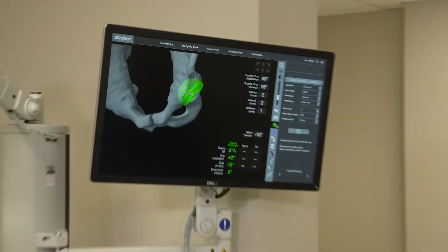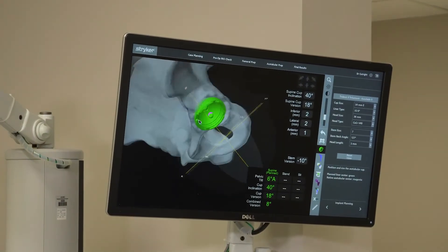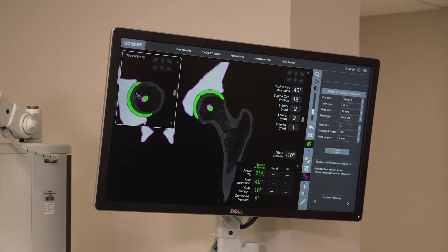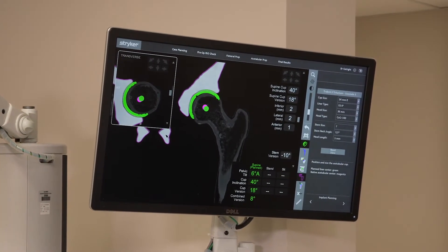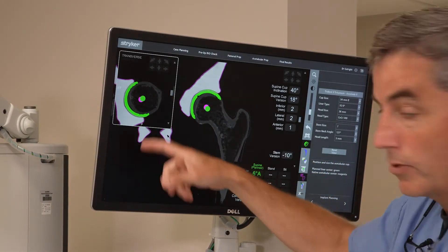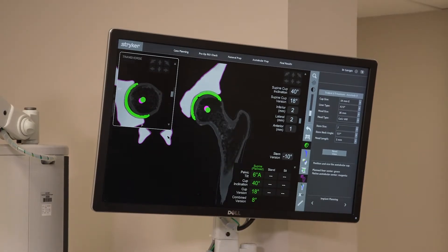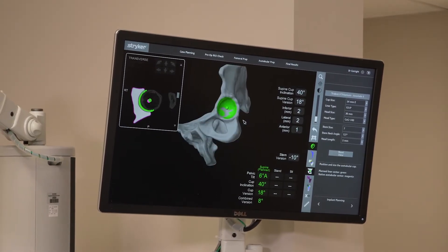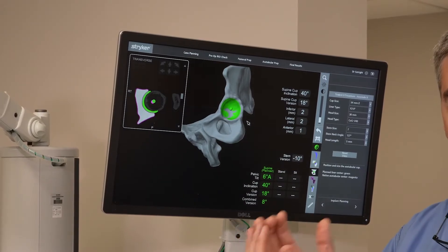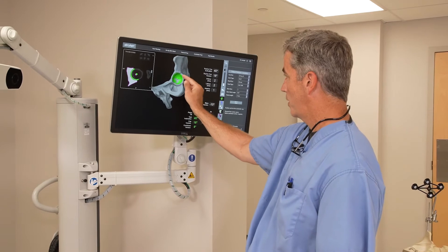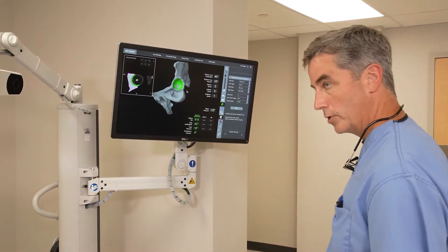The first thing I usually do is go look at the cup — you can look at what the cup's going to look like when it goes in. We actually go look at the bone view, so we can look at how it sits relative to the patient's native anatomy. Sometimes we have to take into account spurs. We'll also look at how much bone we're going to take away when we ream, making sure we're not taking away too much or too little, which will give us some issues.